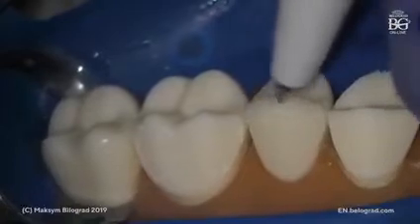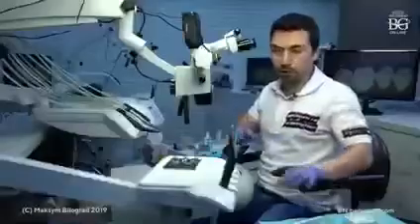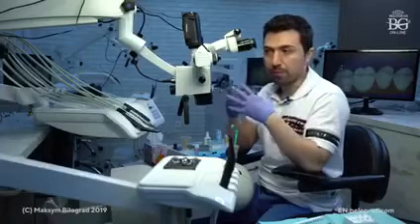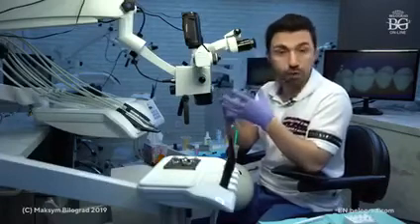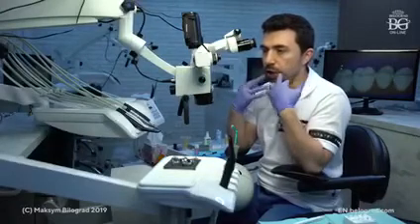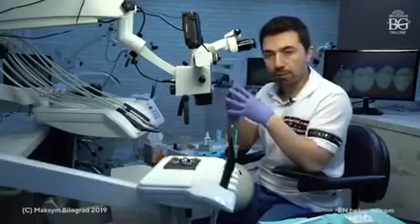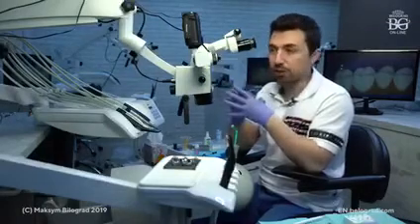This type of preparation can be done when you need to make the tooth longer. So basically you work in the aesthetic area, making the tooth longer, and also you do some occlusal adjustments. For example, you integrate these premolars into group function. Or when you do lower premolars, you know that the buccal cusps of lower premolars are more functional, so you can do this type of preparation for some occlusal rehab cases.